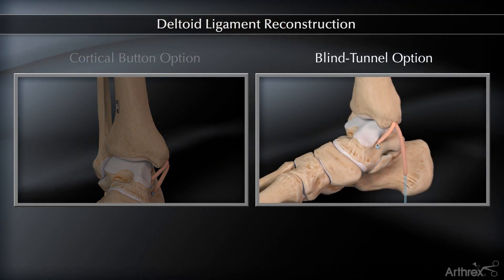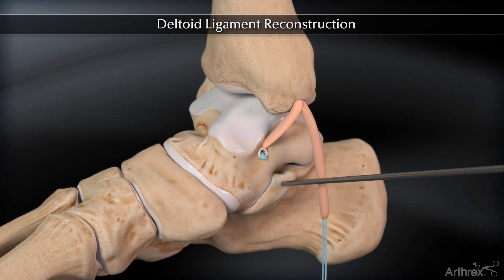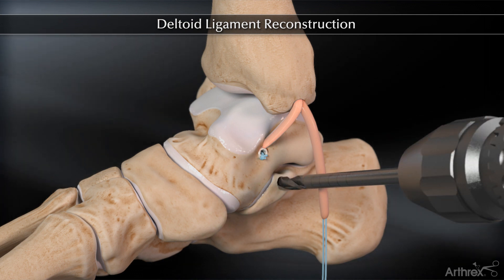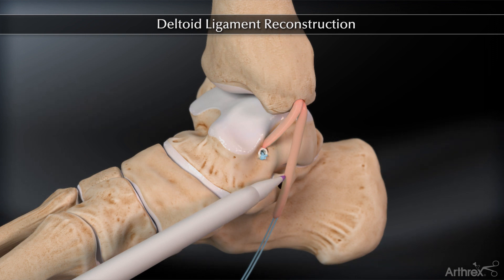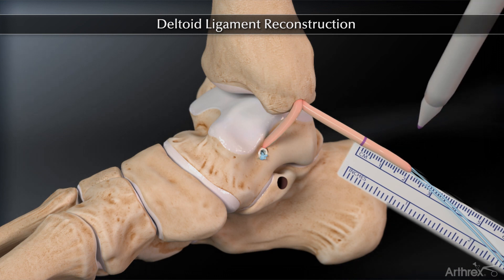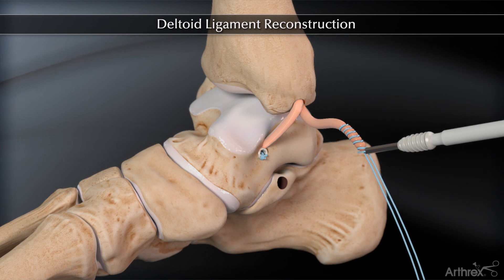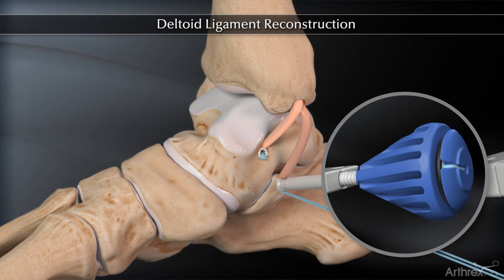Alternatively, calcaneal fixation may be provided solely by an interference screw. In this case, a guide pin is inserted into the sustentaculum and directed slightly plantarly and posteriorly. The guide pin is overdrilled to a depth of 17 mm. The free limb of the graft is tensioned, the insertion site to the calcaneus is marked with a pen, and the graft is trimmed 15 mm distal to this mark. The distal 15 mm of the graft is then whipstitched with fiber loop. The tendon is inserted into the calcaneal tunnel using blind tunnel technique and fixed using the tenodesis screw.